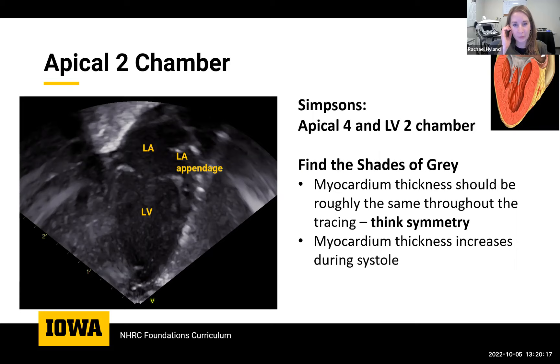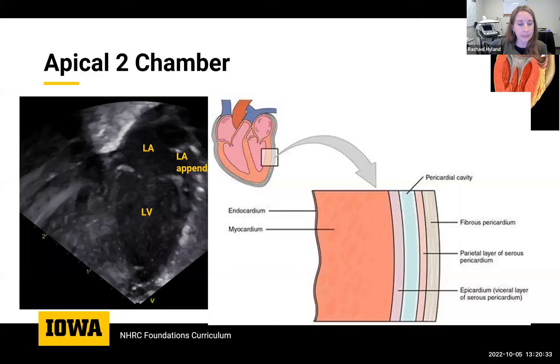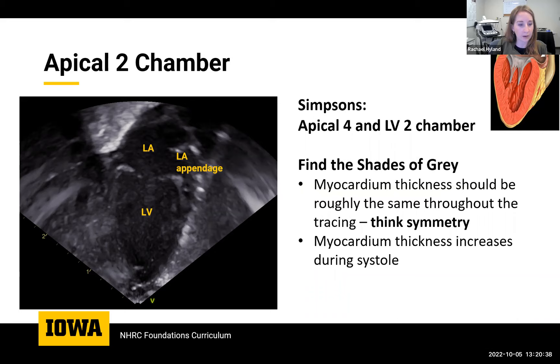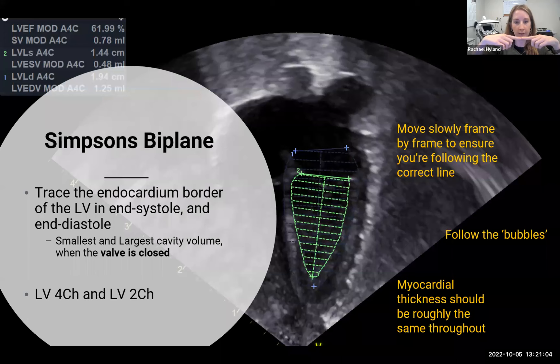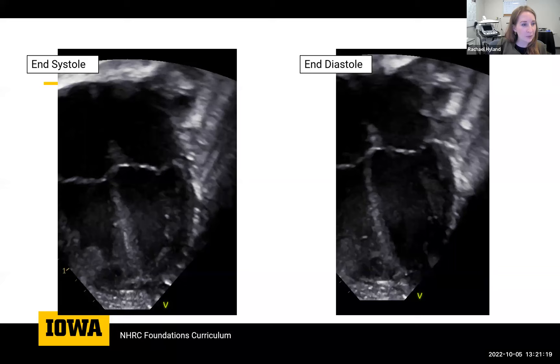Moving into the apical two-chamber view, this view along with the standard four-chamber is used together to measure ejection fraction by Simpson's biplane method. The line you're tracing is the endocardium, the inside of the cavity — don't get confused and trace the pericardium. We trace the endocardium at both end-systole, the smallest cavity volume, and end-diastole, the largest cavity volume. To make sure you're exactly in the right plane, make sure that the valve on top is closed. Moving slowly frame by frame back and forth helps follow the shades of gray — they look like little bubbles when you're on the right line.